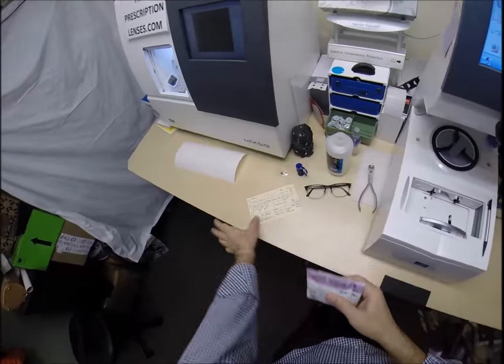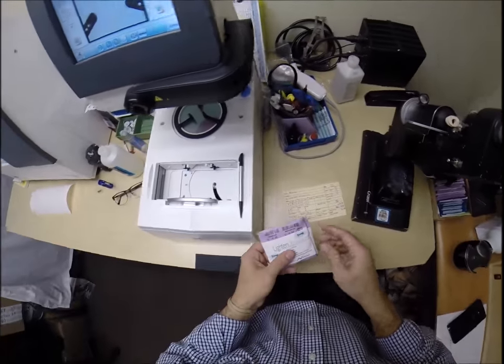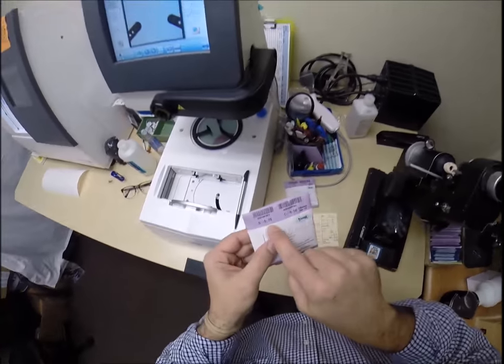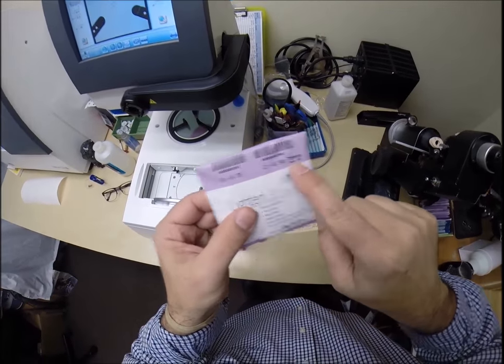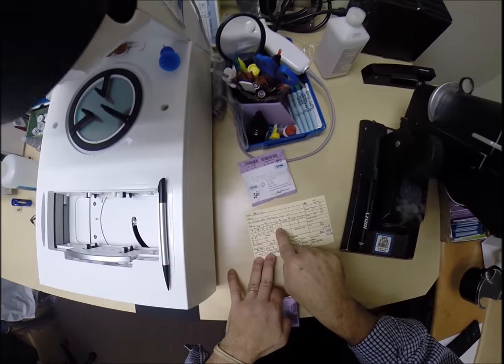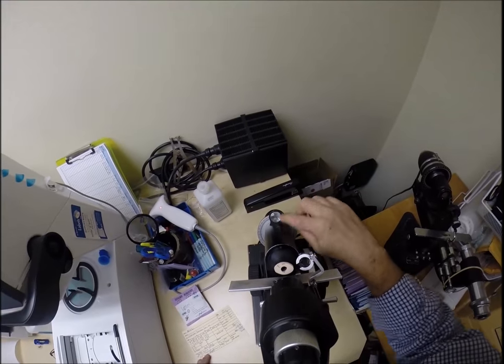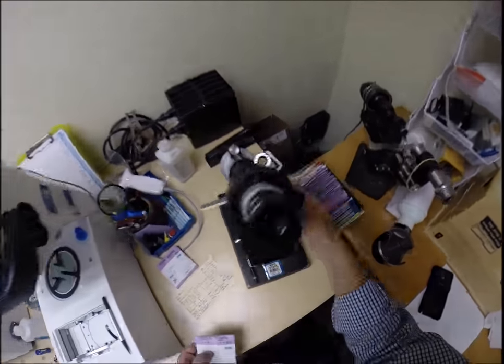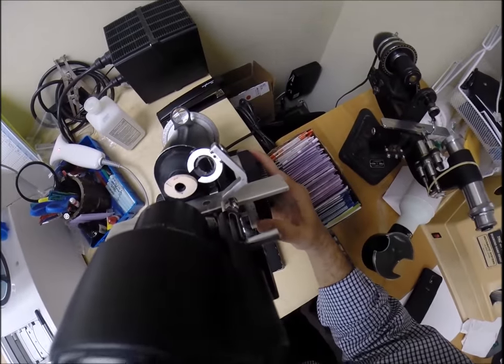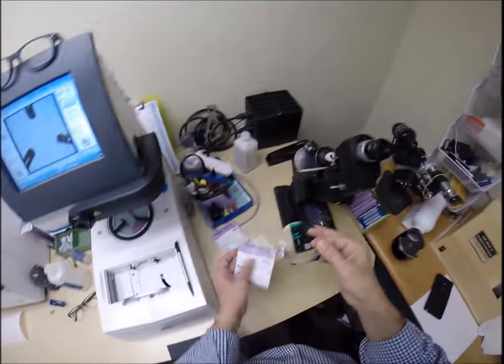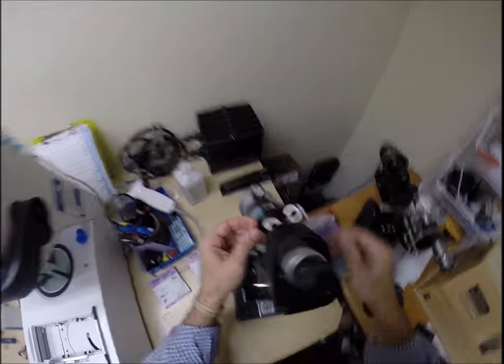So let's come down here to my lensometer. Get your lenses prepped. Your right lens is minus 575, minus 50 at 170. Turn the axis wheel to 170. Let's make sure that is on. First one of the day that gets shipped. Take the lens out of the protective sleeve.